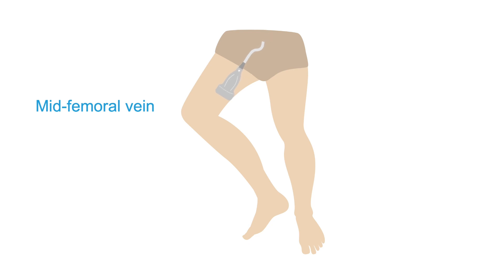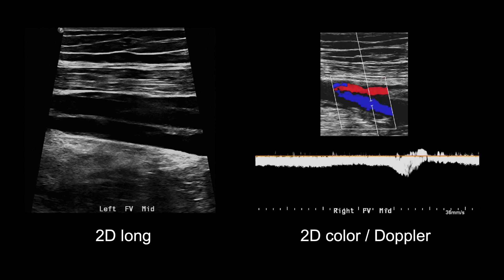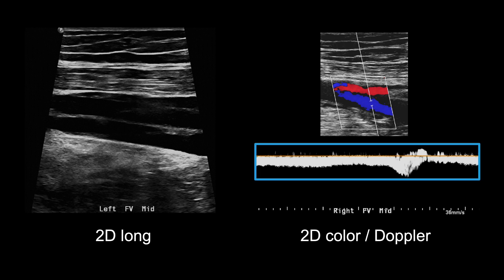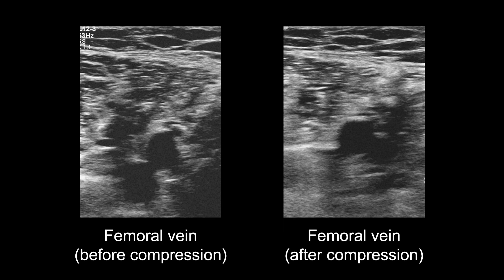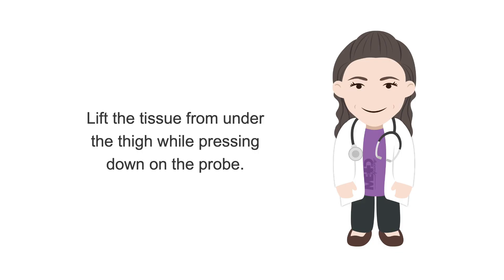Continue to compress the femoral vein every couple of inches down the medial thigh to the mid-femoral vein in the mid-thigh. After compression at the mid-thigh femoral vein, obtain a 2D image in long view, then add color, checking for any filling defects. Perform PW Doppler phasicity analysis and augmentation if desired. The distal femoral vein dives deep into the tissue, and ultrasound depth will likely need to be increased. Record a distal femoral vein compression to check that the vein fully compresses, where only the artery remains visible after compression. Remember to use your other hand to lift the tissue from under the thigh while pressing down on the probe for the least painful patient experience.